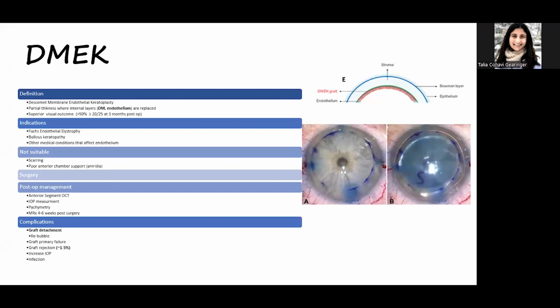So then DMEK. DMEK is a little bit similar to the DSEK. It's just that different layers are being transplanted, and also the kind of patient that will have a DMEK surgery done is different. And the visual outcomes are very different.